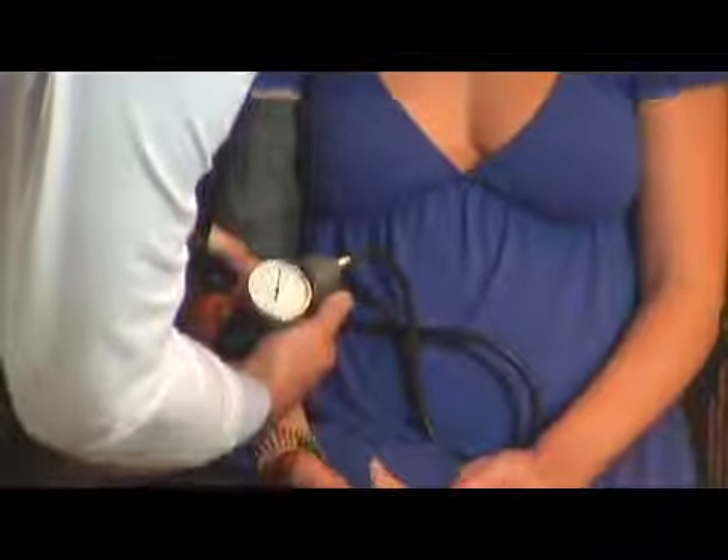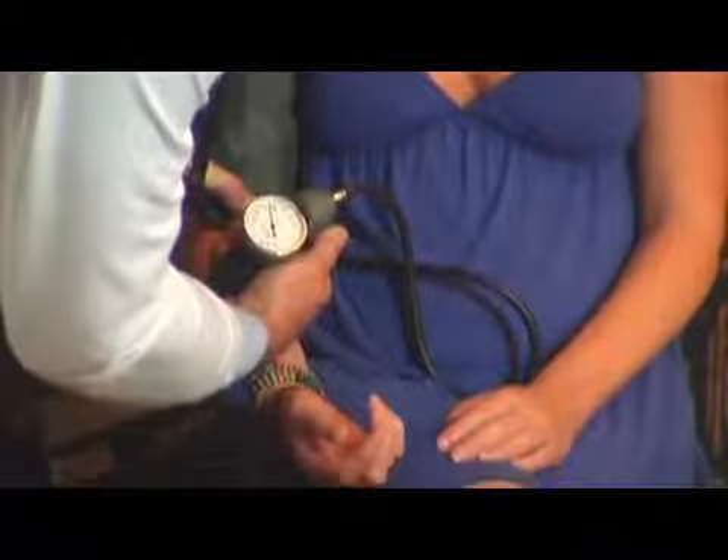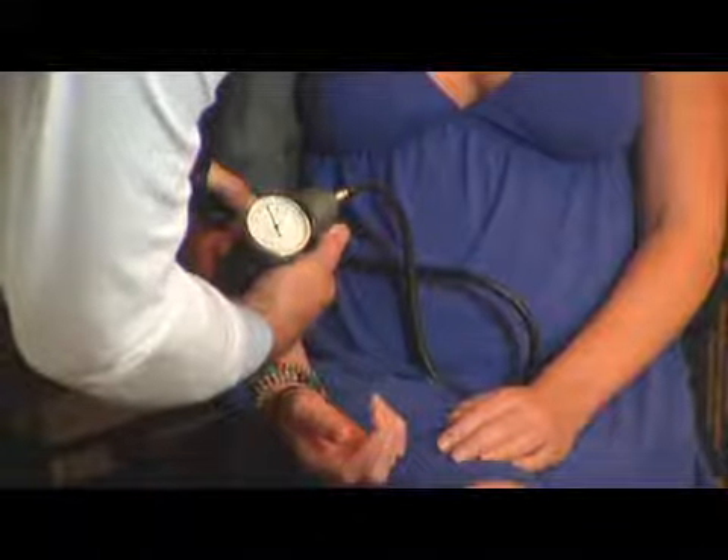A lot of times in the medical profession, we refer to the white coat effect. Patients come in and they're nervous for being at the doctor's office — they see the white coat and their blood pressure goes up. So we wait 10, 15, 20 minutes, talk to them, relax them, get things off their mind, make them comfortable, and then recheck it. Usually it has come down within 10 to 15 minutes.